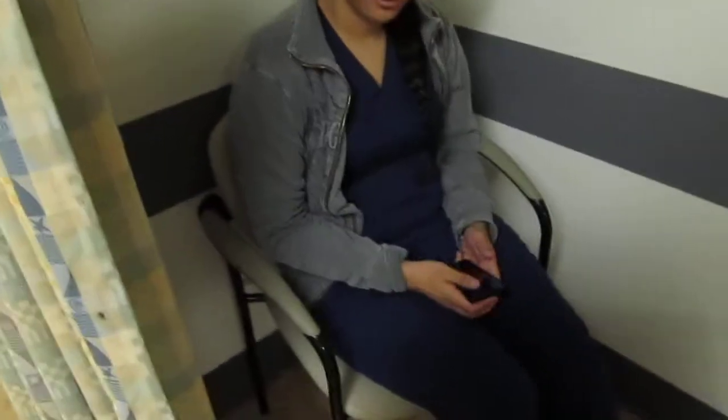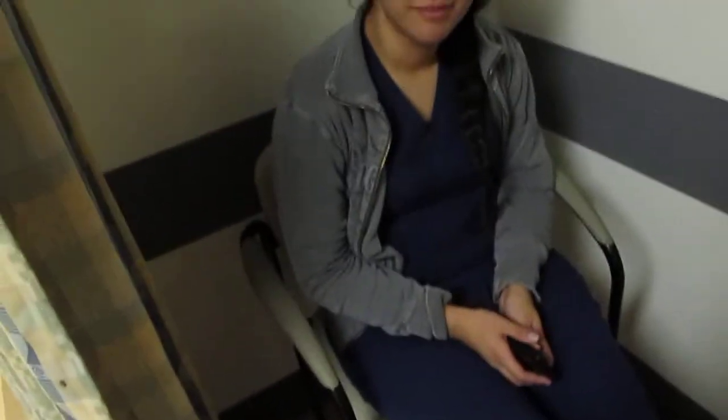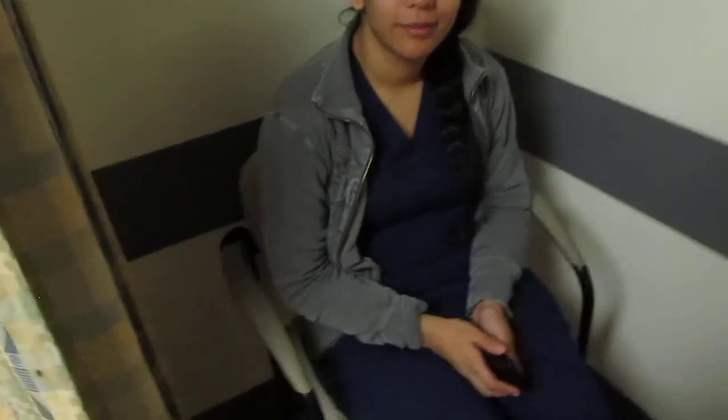Jane Smith. Here's my patient. Your last name, ma'am? Smith. Smith. And your date of birth? 10/27/89. Okay. My name's Evan. I'm gonna do a chest x-ray today, so come on back.